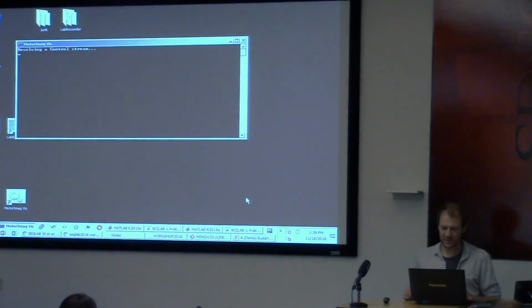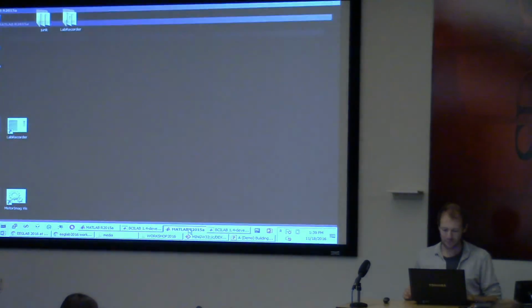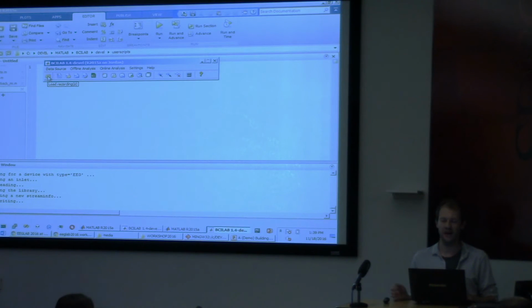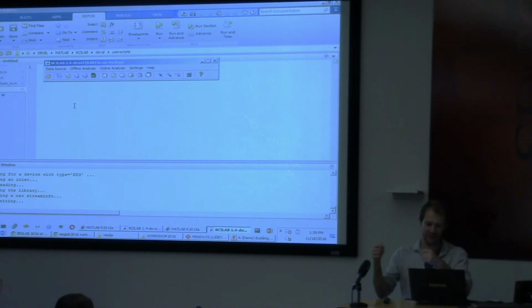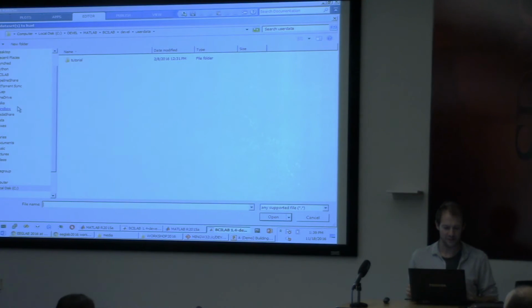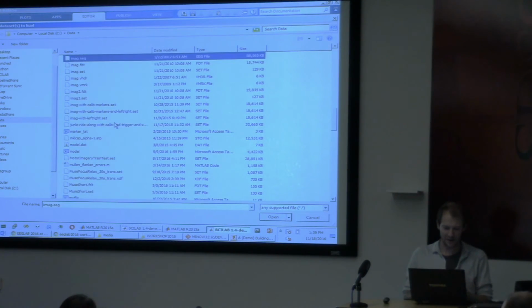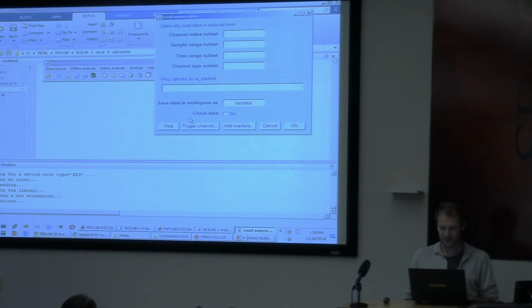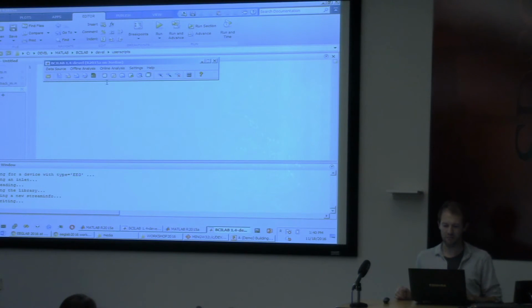Now what you could have done is maybe you would normally do a bit more R&D, right? So maybe you actually want to assess this offline instead of putting the subject under the cap, and then if it doesn't work you say sorry and give them $15 or something. So basically you can load another data set, so let's call it last data 2. That's actually one we also played back. And now you can apply that model we still have in memory to that data set.